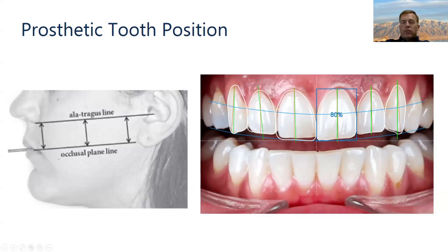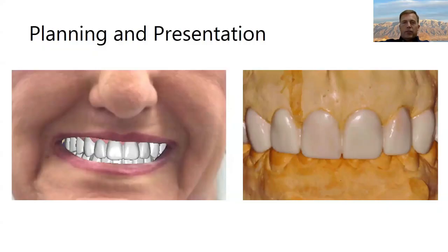So these are some rules we want to follow as we're building our prosthetic plan that'll then drive everything else. Okay, so you've got an awesome prosthetic plan. Now what do you do? In this digital workflow we're talking about today, the prosthetic plan will be the teeth and the bite that the patient gets in the provisional on the day of surgery. Not only that, but those tooth positions are going to direct the alveoplasty if we do any and the implant placement. Again, the ideal implant placement is going to be determined by this prosthetic plan, not necessarily where the teeth are now.